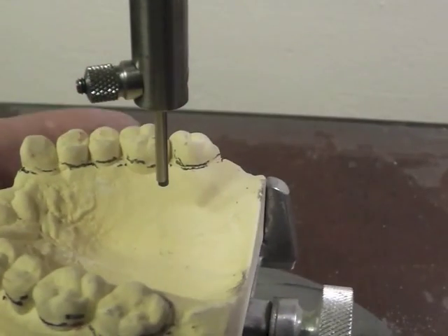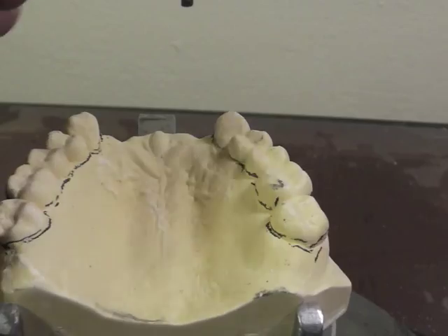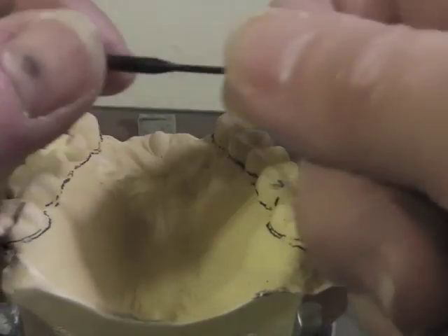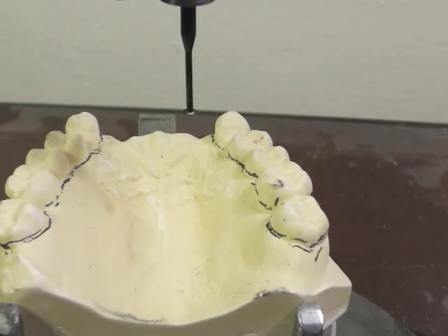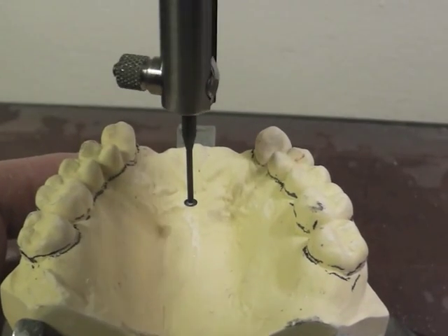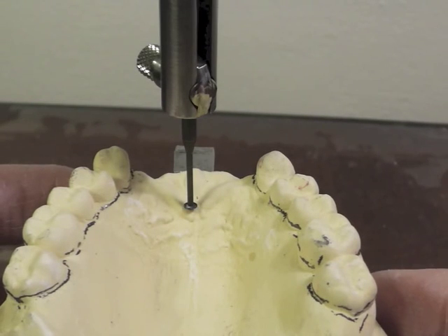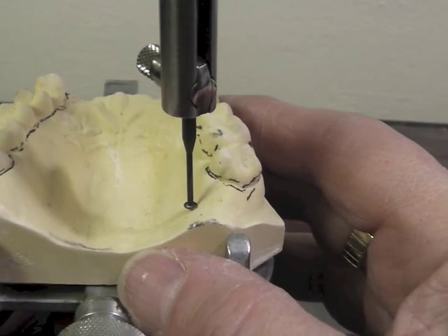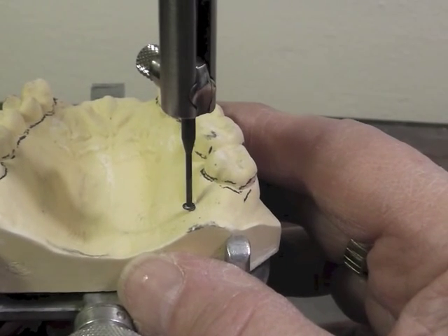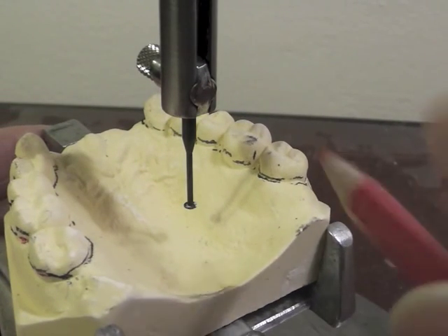Mark all the teeth because you need to know where the height of contour is for all of them. Then I'm going to do something called tripodding the cast. I'm taking the lead out and putting in the O3 undercut gauge — this old surveyor has a black one, but you will have one with three notches on it. To tripod the cast, you raise the rod and look for three spots that are widely spaced and touched by the side of that O3 gauge.